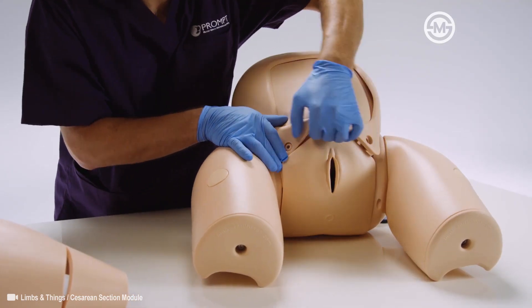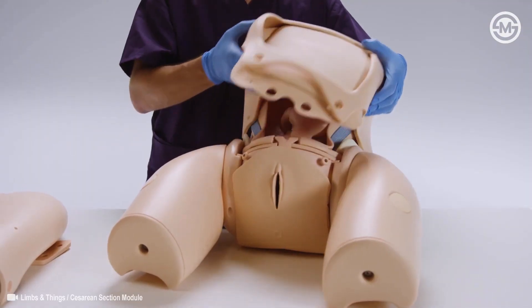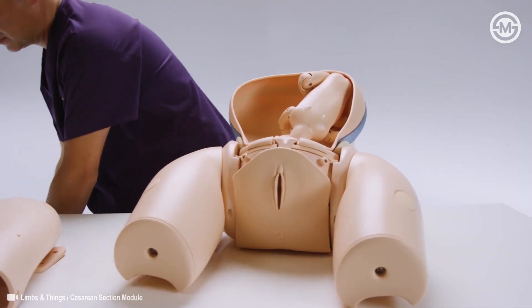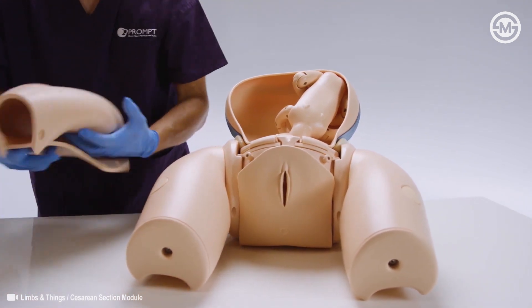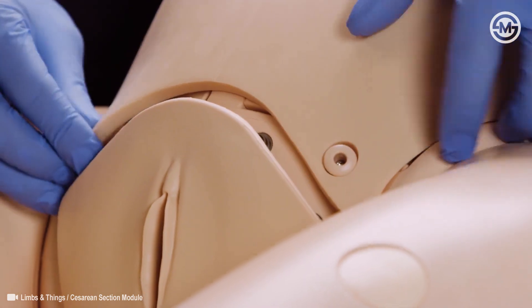The module can be used to train incision, delivery and closure using the surgical pad, and repeated routine or difficult deliveries through the pre-incised abdominal skin, and can be set up as a simulated patient.